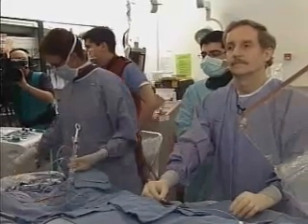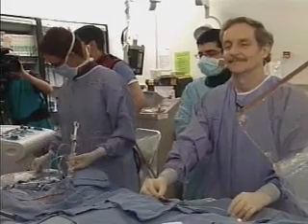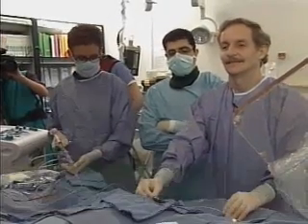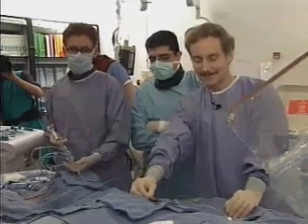It was very reassuring, though, to know that this vessel was close to 4 millimeters, which gave, I think, Dr. Campbell a little bit of liberty there to go to pretty high pressures with that 3.5 millimeter balloon. Without the intravascular ultrasound, I'm not sure he would have wanted to take it quite that high, but I think he's pretty comfortable. Is that fair, Bill? That's very fair, yes.